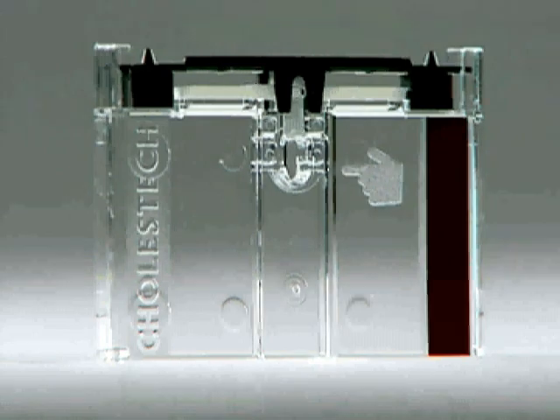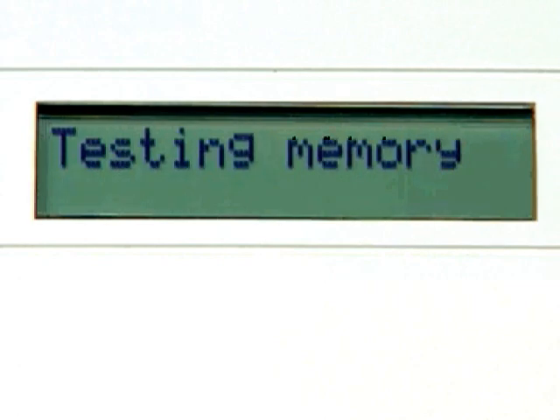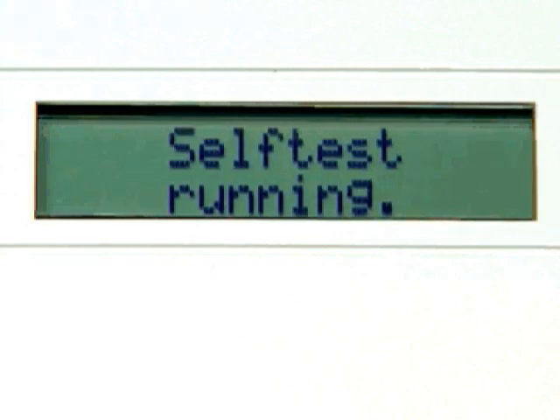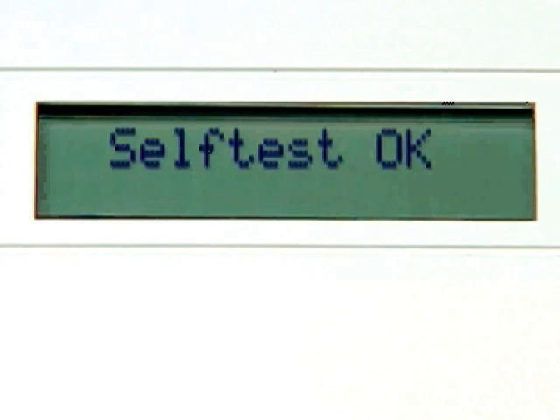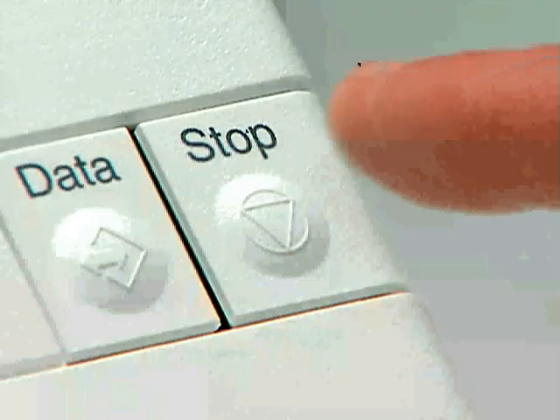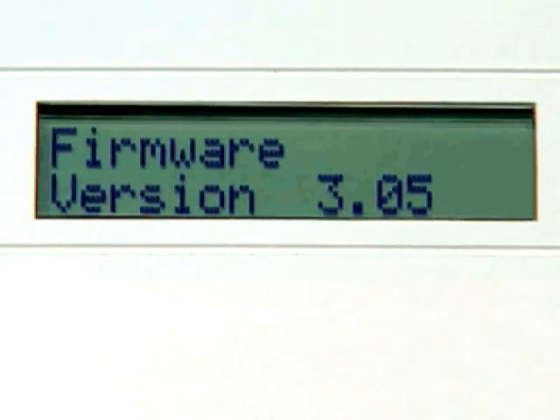After plugging in the Cholestec LDX system, the words TESTING MEMORY will appear on the LCD screen. The system will be ready for use after a brief warm-up period and will run a self-test, which ends with the message Self-Test OK. Before you start using your analyzer, it is recommended that you set the information in the Configuration menu. To enter the Configuration menu, hold the Stop button down until the firmware version appears.